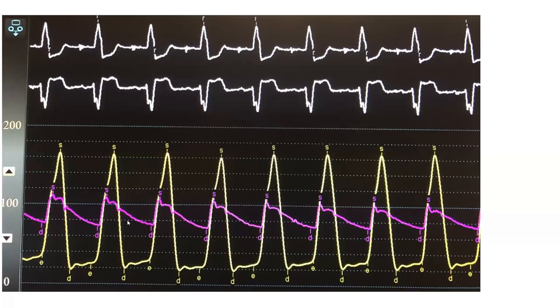This is hypertrophic obstructive cardiomyopathy, and here is how you can tell. This is a classic dynamic LV-OT obstruction. You see the LV and aortic pressures hug each other at the beginning of systole. Then later on in mid to late systole, you start having that dynamic LV-OT obstruction. The LV pressure will start peaking late in a late dagger shape morphology, and the aortic pressure will drop in a spike and dome morphology because the obstruction occurs late. The dome is as the aortic pressure drops after the initial rise when the obstruction happens.